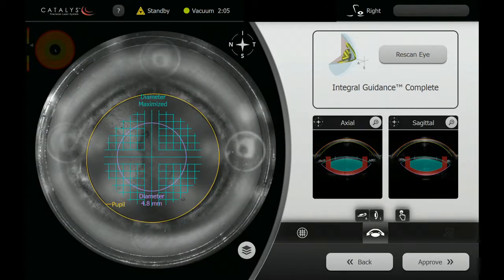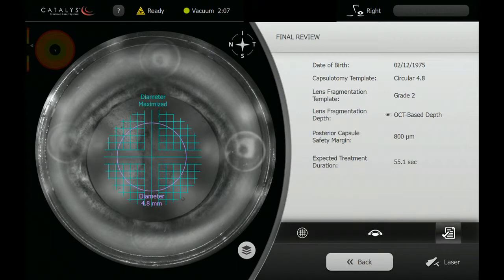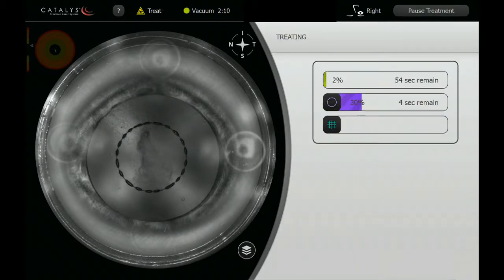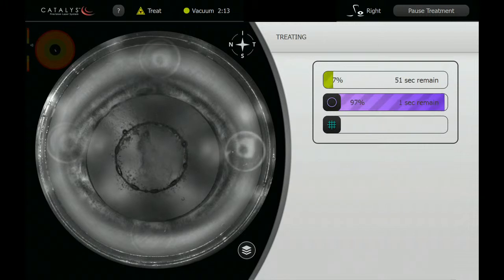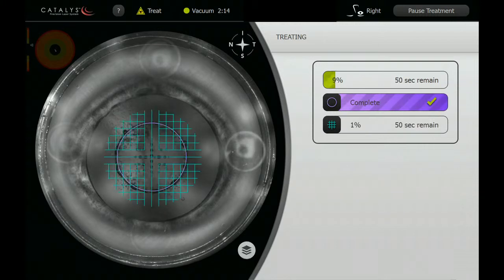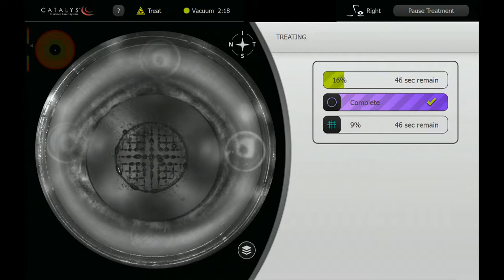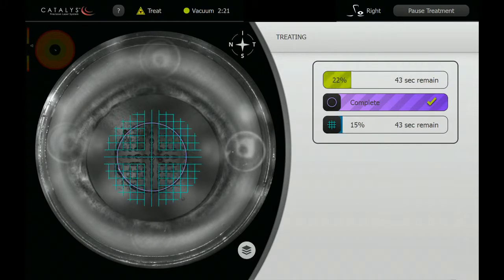Please note that there's minimal nuclear sclerosis. The pupil is noted to be still concentric within the outline, as noted by the computer. The capsulotomy is efficiently applied with a 360-degree champagne bubble formation.